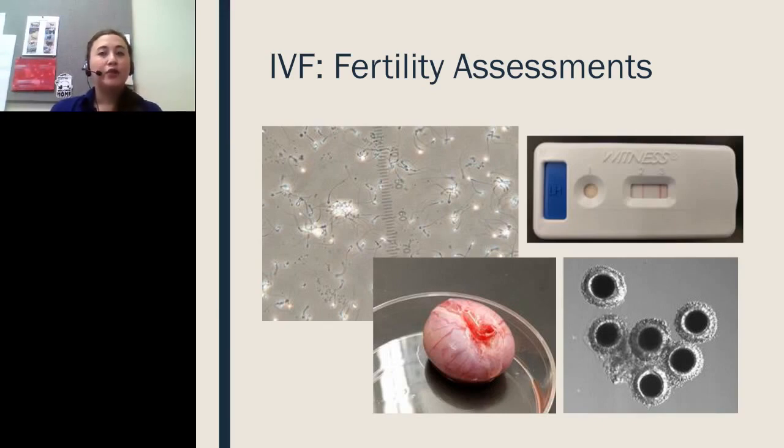And for 2 of the 3 females, we did produce embryos, which are currently frozen, I believe, in liquid nitrogen up at Cornell University. And for the 3rd female, she did not produce embryos. She had ovulated oocytes, and I think that was actually due to poor timing of the spay and oocyte collection. So that is really a critical component of this whole process right now.